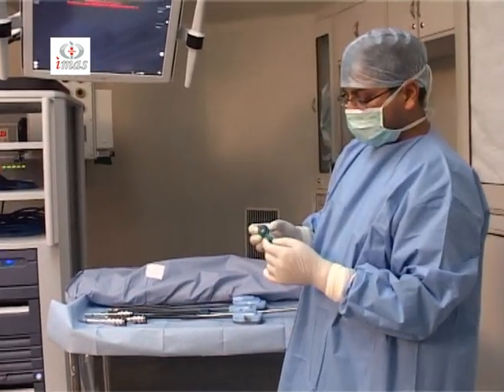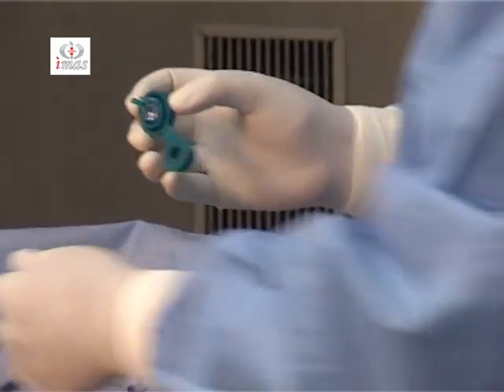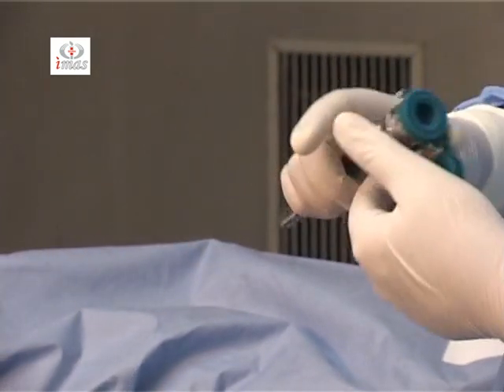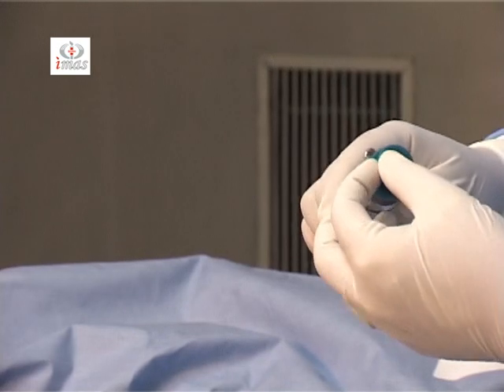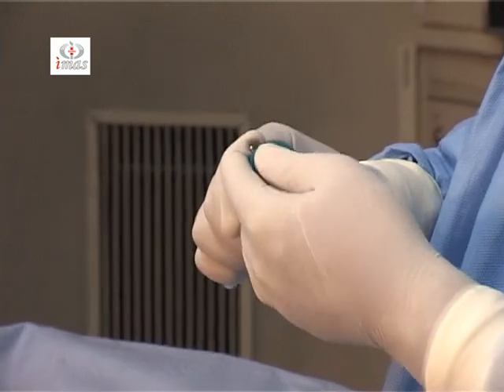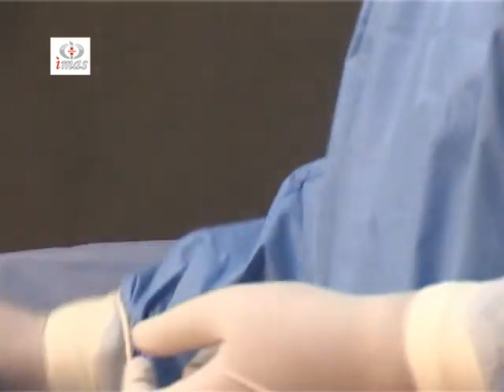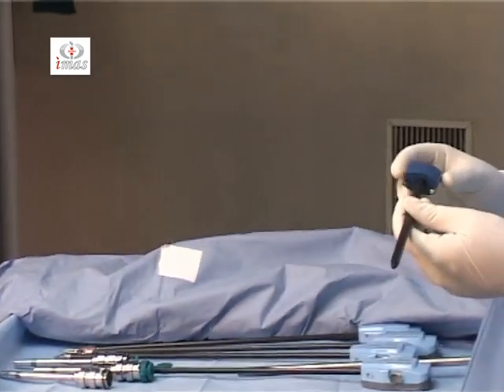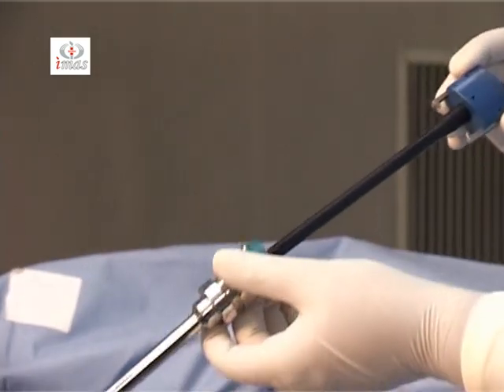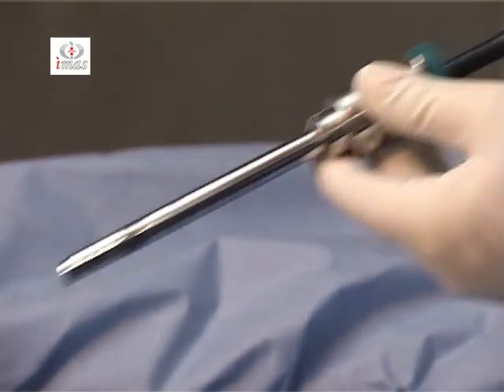These are the disposable seals which come with the drape set, and these are applied onto the 8mm trocars, and if you wish to put in a 5mm instrument, you have to press the seal like this, and you can easily insert a 5mm instrument through the same port. This is the blunt obturator which is inserted into the port to insert it in the patient's abdomen, and it can be taken out like this.